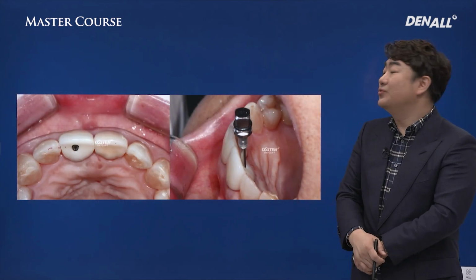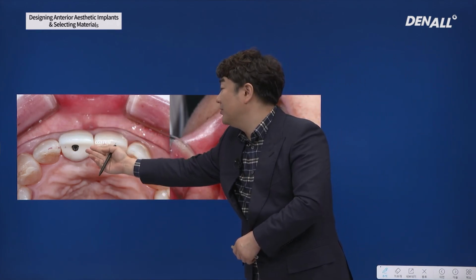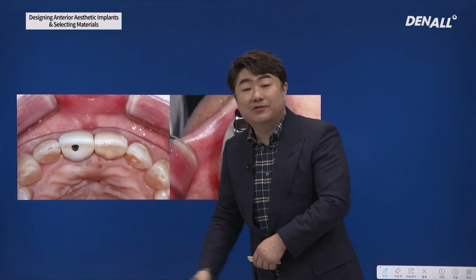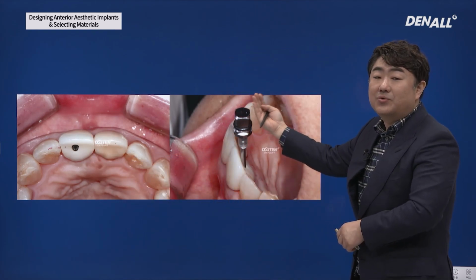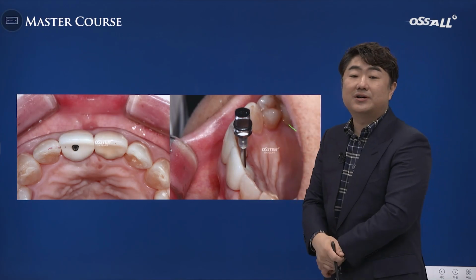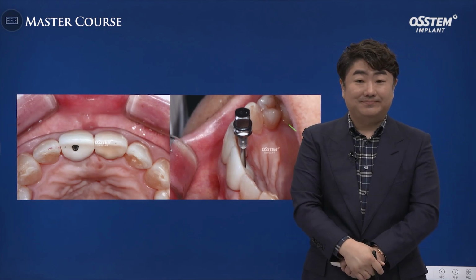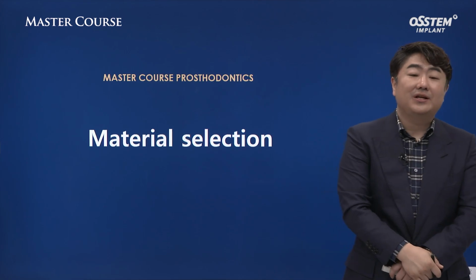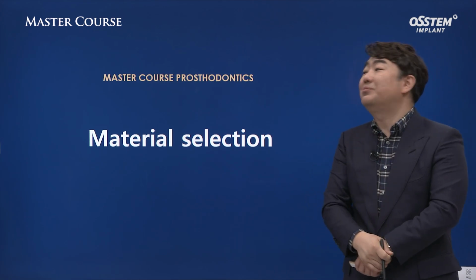After adjusting abutment, following the changed position, hole is formed on the crown. You put the angle driver in the abutment, and when you scan this, it can be of help in determining hole position. I've talked about design thus far. I want to talk about material selection right now. There's a slide that I wanted to show you.